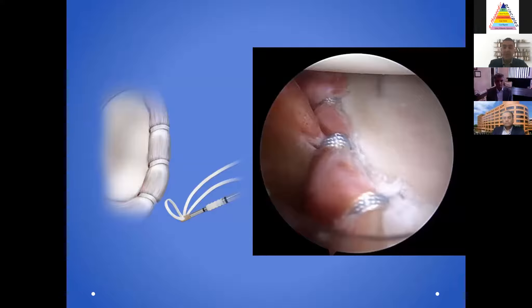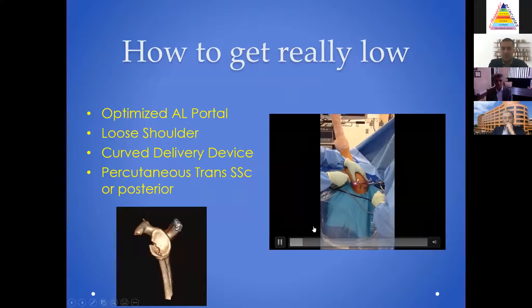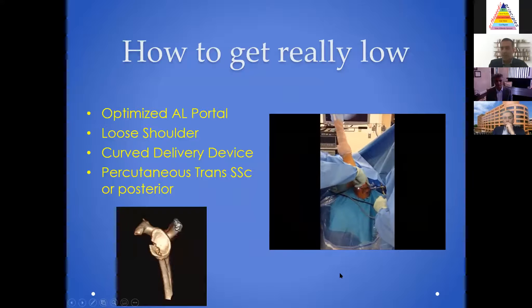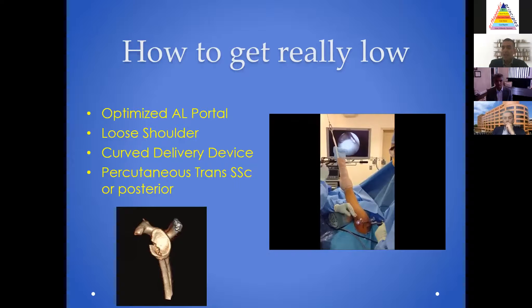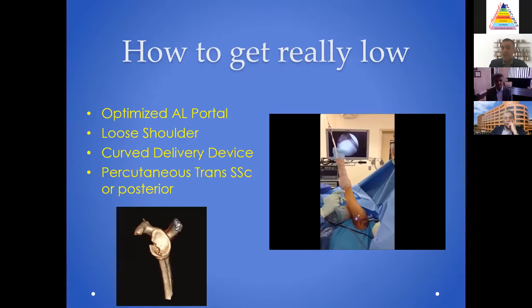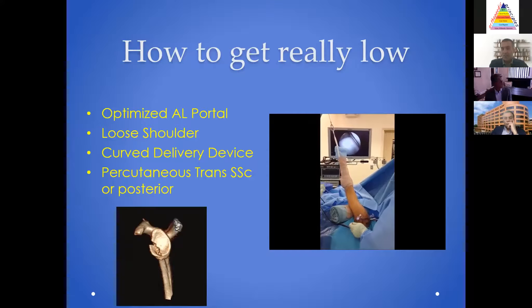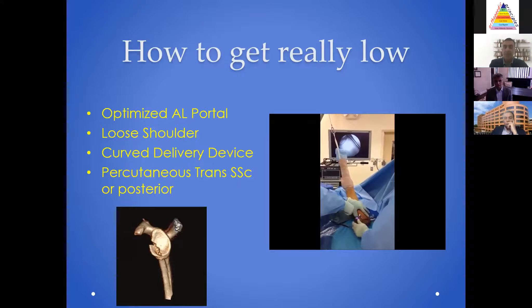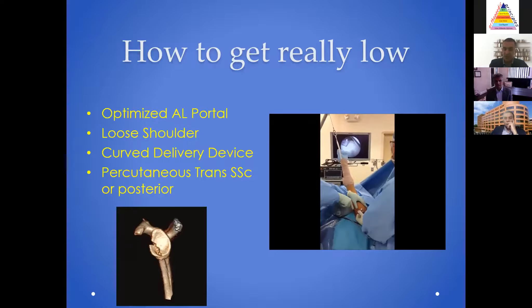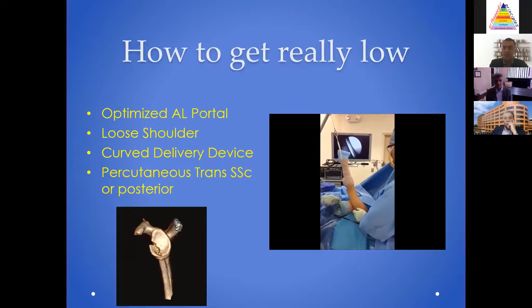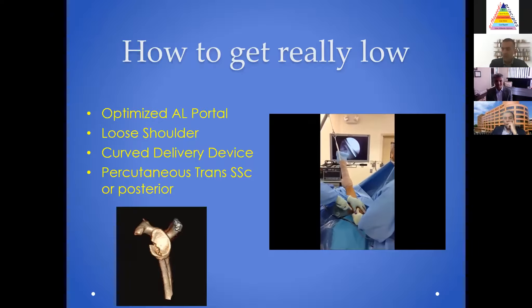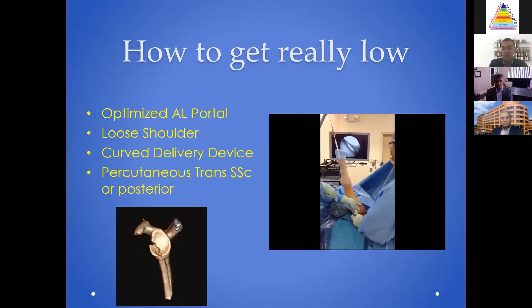You want to get down really low and address the inferior tissue — that's the hardest and most important part of the case. You can do that through an optimized portal, getting down low on the subscapularis. In a loose or multidirectional shoulder, this is quite easy. Using curved delivery devices can become important, and you can also go percutaneously trans-subscapularis to place an anchor. An important tip: don't skive consistently with three drill holes and create a potential postage stamp or glenoid fracture. Be perpendicular to the glenoid in each drill hole.